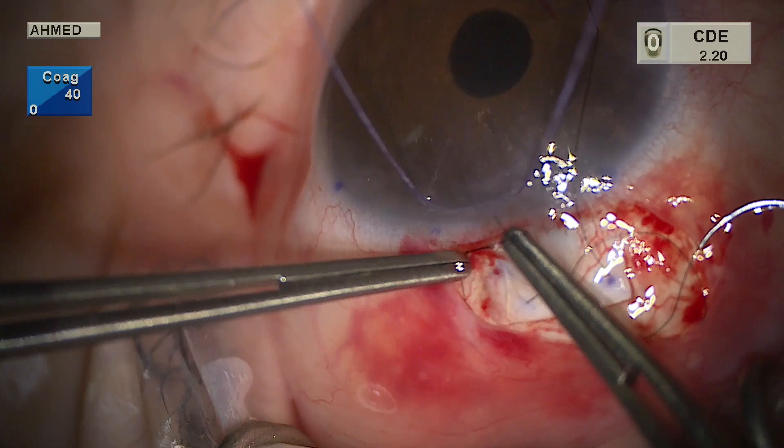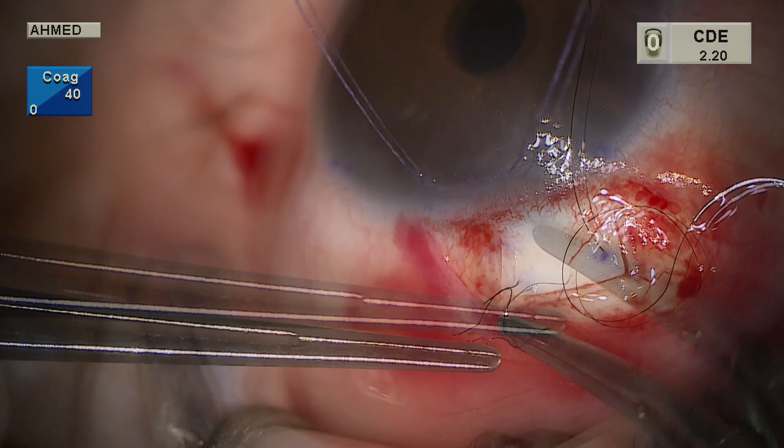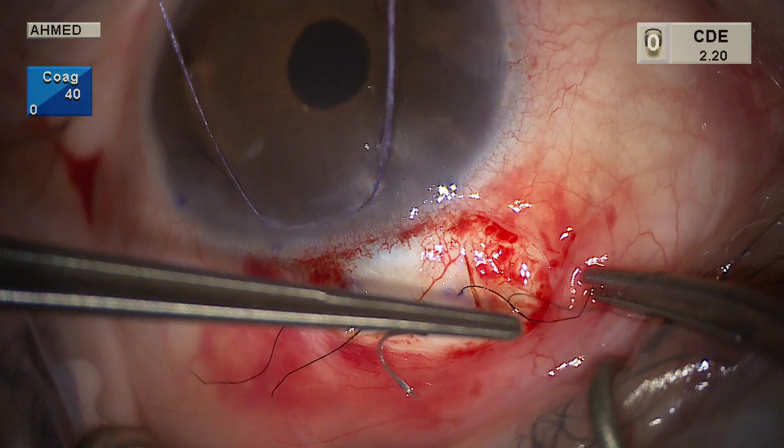We are now ready to lock the sutures in place. Slip knots are used — two throws in the same direction. By creating slip knots, this allows us to titrate the tension after BSS is injected into the anterior chamber. One slip knot is placed on the left and one on the right. Typically two sutures are all that is needed if the flap is created with the right thickness and dimensions.